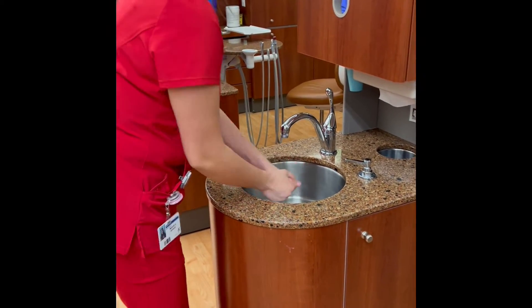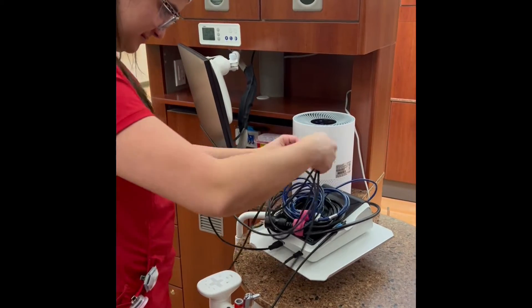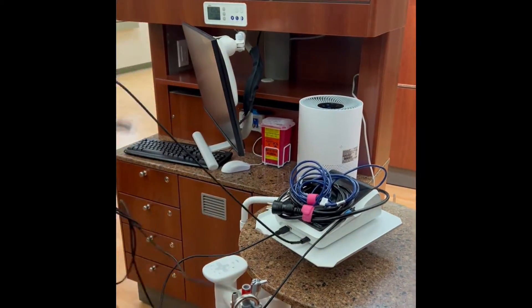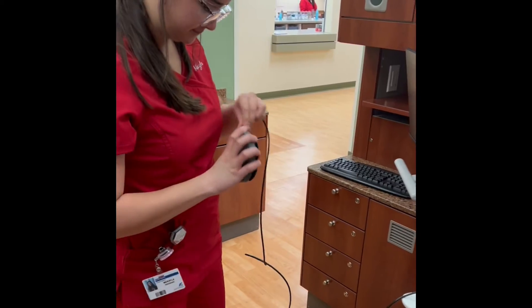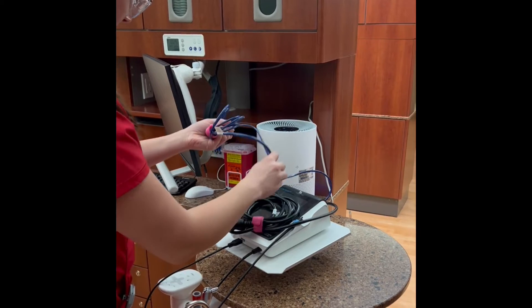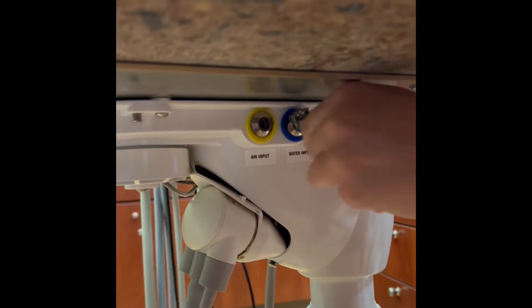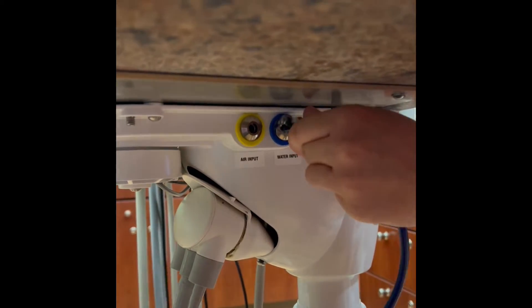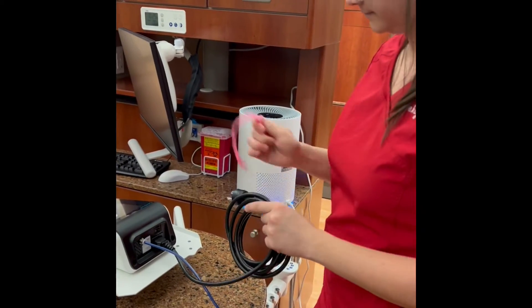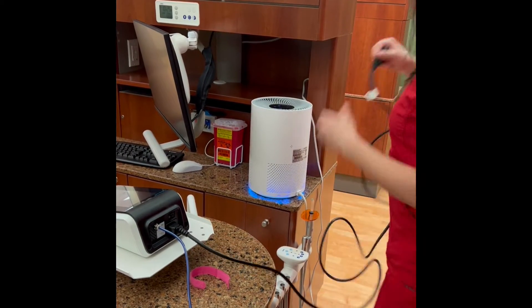Always start the day with hand hygiene. Get the Cavitron out and unravel the cords. Ensure the foot pedal is plugged in. Connect the blue waterline from the Cavitron to the blue connection on the unit. Plug in the power cord.